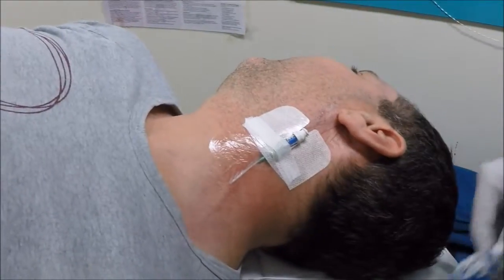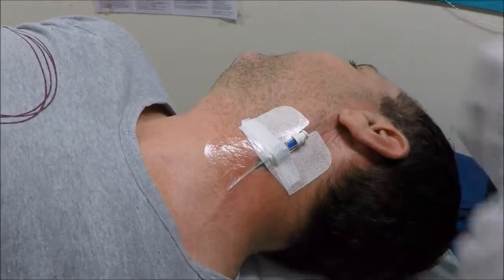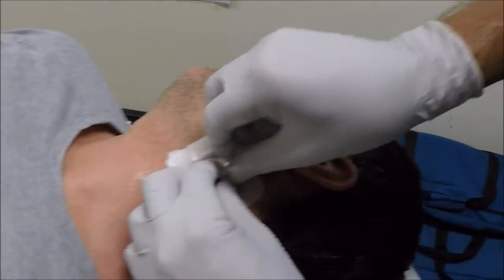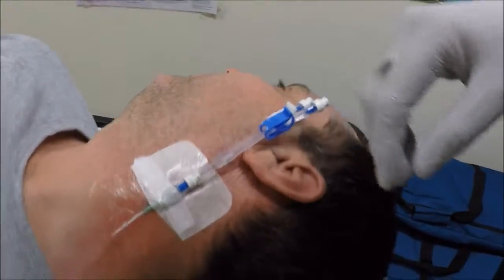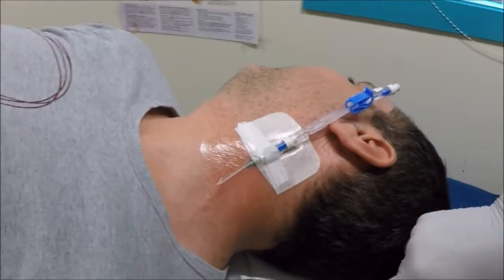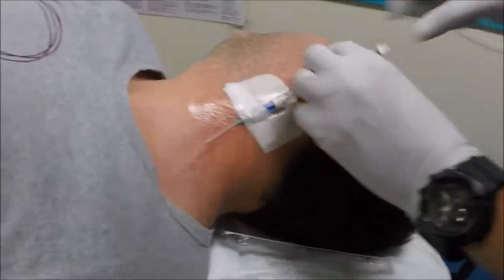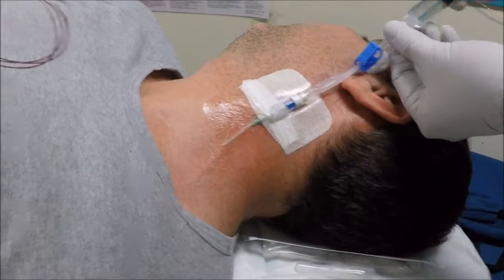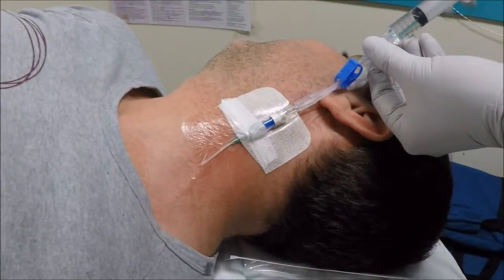And then I would attach my pre-flushed fluid line. It's a bit easier to access. So sharps into the sharps container. And then we could flush our cannula just to ensure patency, which we have, a patent cannula.